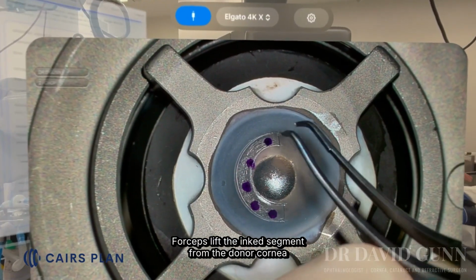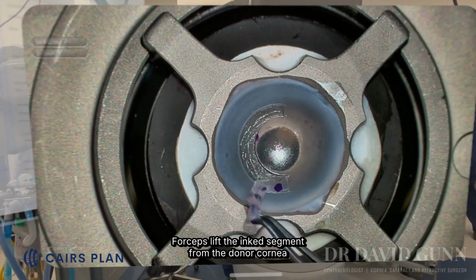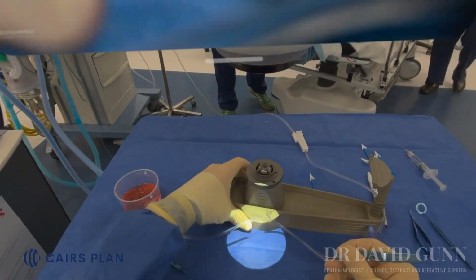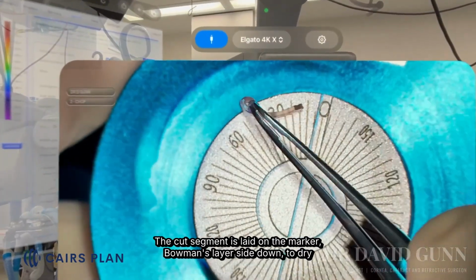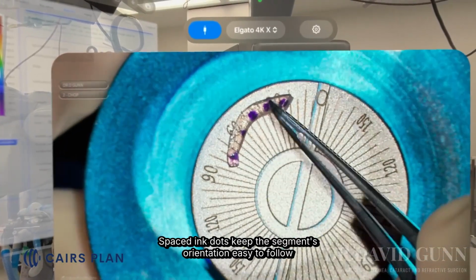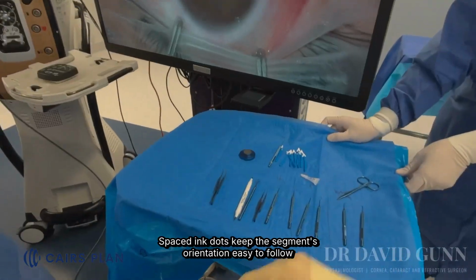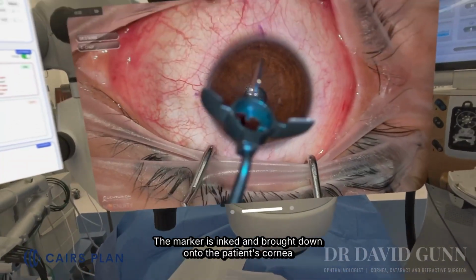Forceps lift the inked segment from the donor cornea. The cut segment is laid on the marker, Bowman's layer side down, to dry. Spaced ink dots keep the segment's orientation easy to follow. The marker is inked and brought down onto the patient's cornea.